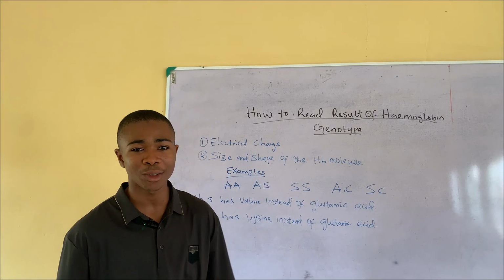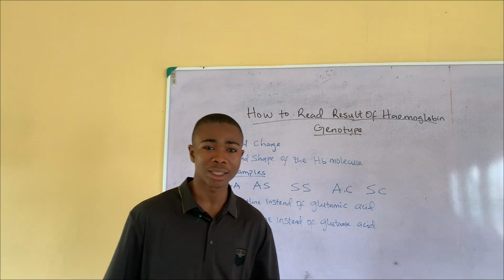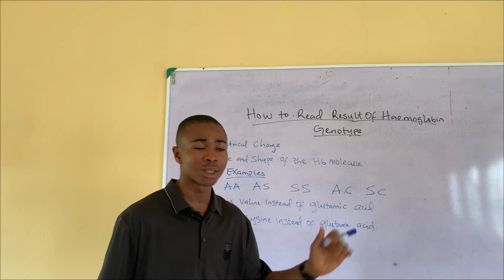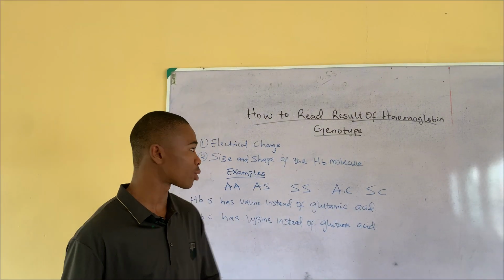Alright, I made a video on how to carry out hemoglobin genotype using an electrophoresis machine, and people demanded that I should do how to read the results. So in this video, I'll be showing you how to read the results.